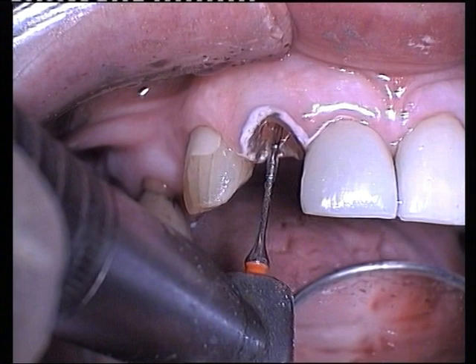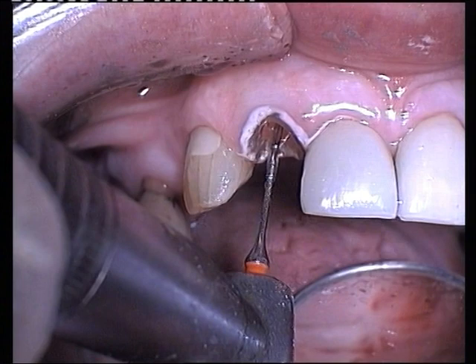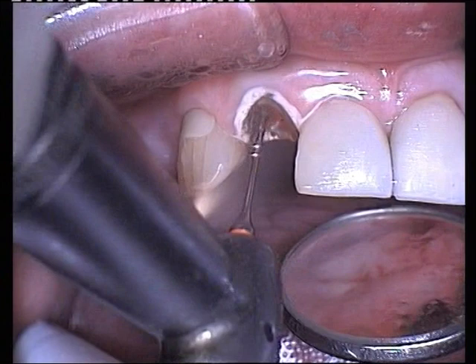Using the burr supplied by the manufacturer, the post hole is prepared in the root canal. This is followed by a burr to make a template of the carbon fibre post.